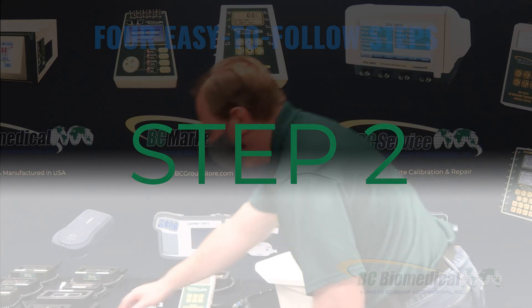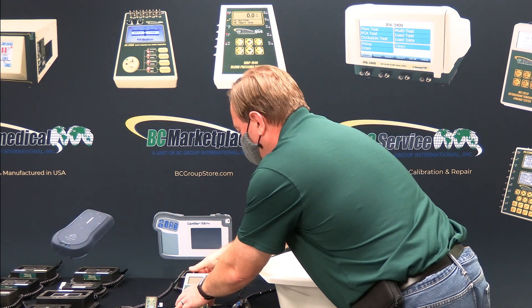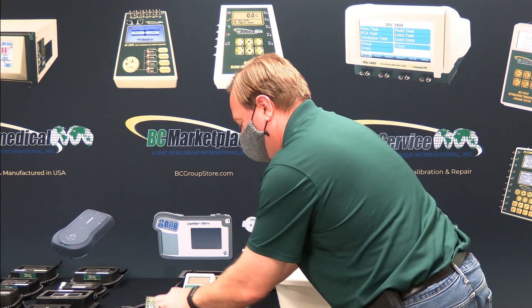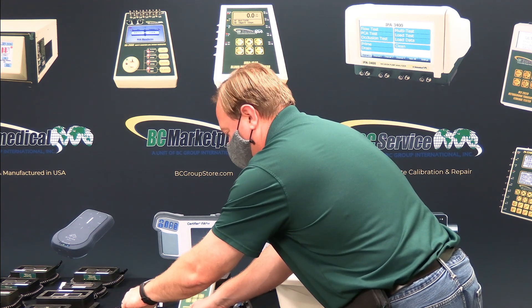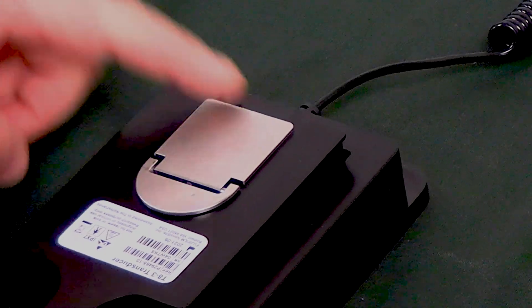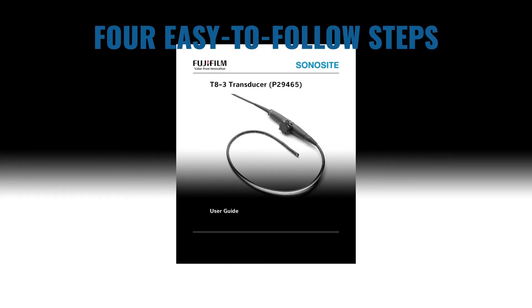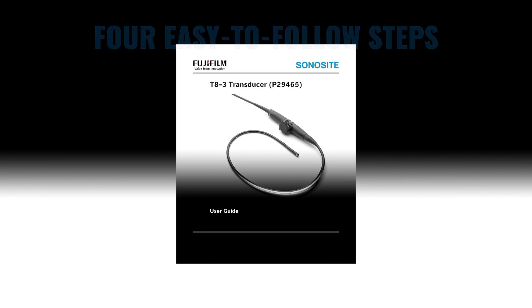Step 2: Connect your equipment. To start, plug in the ULT-PA32 transducer adapter into the ULT-2020. Next plug the ultrasound transducer into the adapter and the adapter should click into place. Look into your ultrasound transducer manual for OEM recommendations on connecting your transducer.